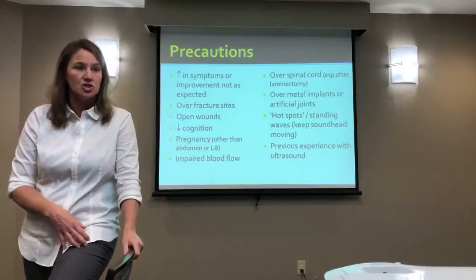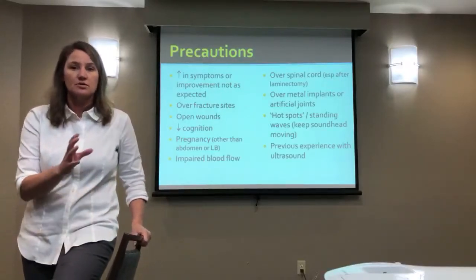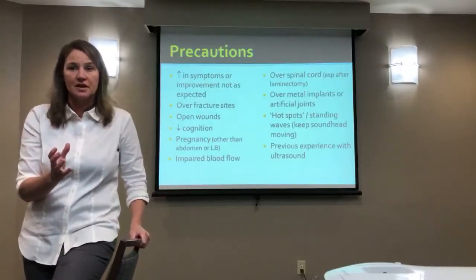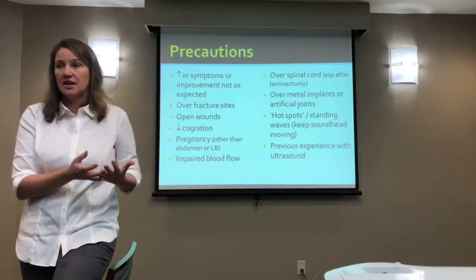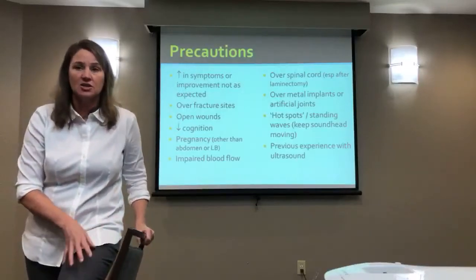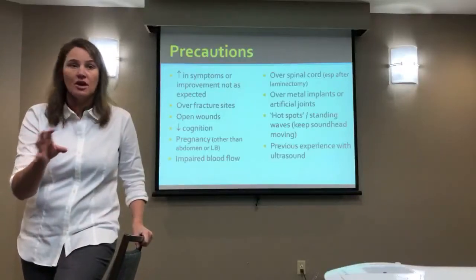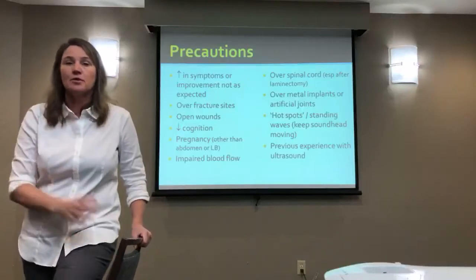Now ultrasound is generally what's recommended for a non-union or for a poor prognosis for healing. And it's worn for a much shorter period of time. So what was once, when I learned in school, a contraindication, over a fracture site, you could not do it, you should not do it, right, is now an actual indication. I don't know that they're actually being sent to physical therapists or occupational therapists for this purpose. I think it's simply a modality that's being used.